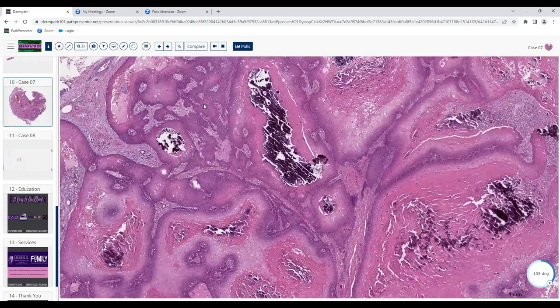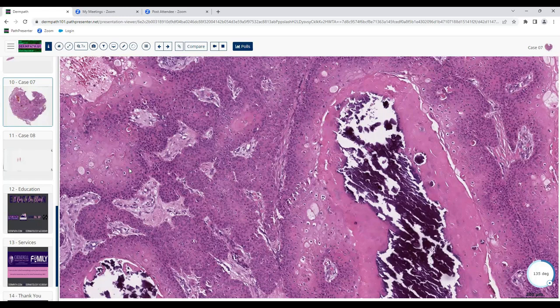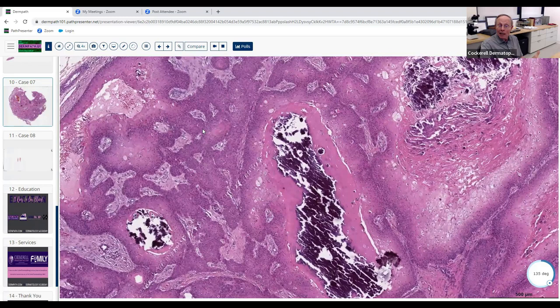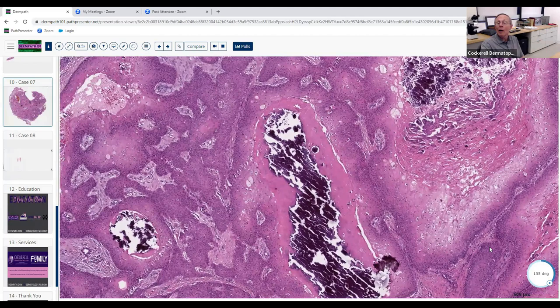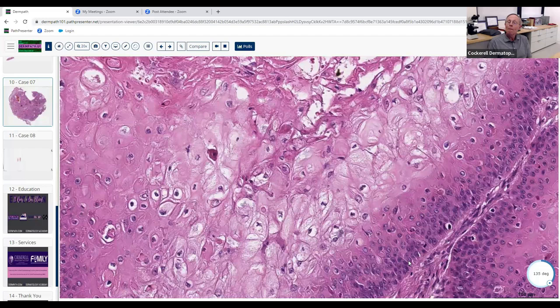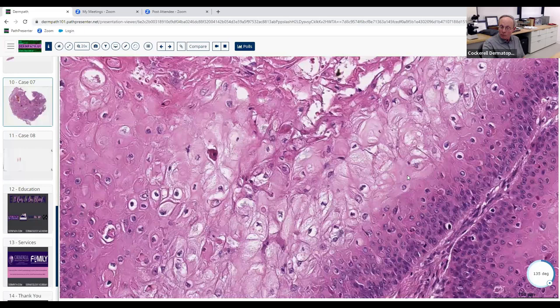Which part of the epithelium? Maybe tricholemmal — the root sheath? Yes, exactly. We already saw tricholemmal differentiation in our first case. At the periphery of these nodules you have basaloid cells, then clear cells internally — the outer root sheath — without the ghost cells you'd expect in pilomatricoma. The clear-staining cells correspond to the external root sheath layer before the internal root sheath, demonstrating tricholemmal differentiation with cornification forming and some calcification.